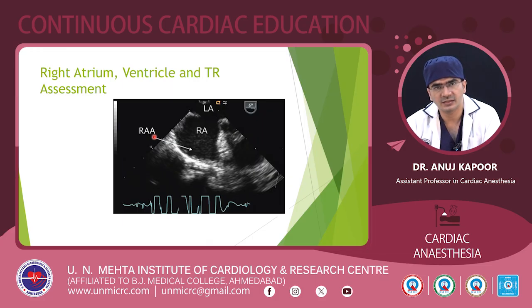Similarly, the RV dilatation and the tricuspid valve. Through the tricuspid valve, if TR is there, we can get the pulmonary artery systolic pressures, and thus we can assess the pulmonary pressures through this.